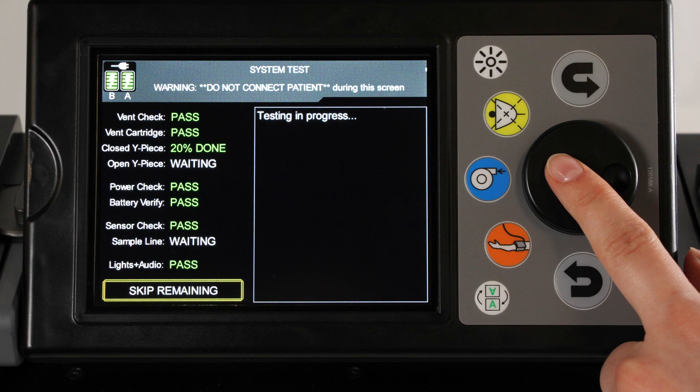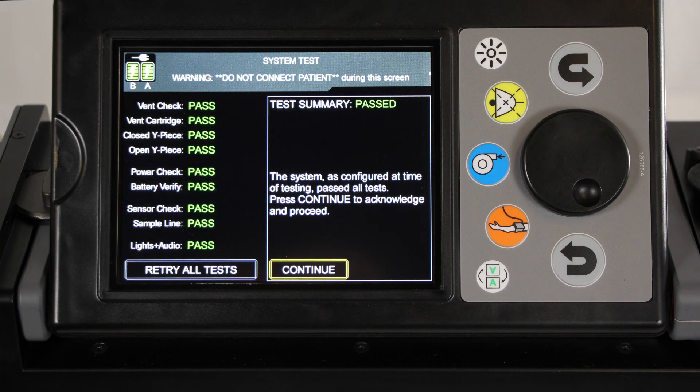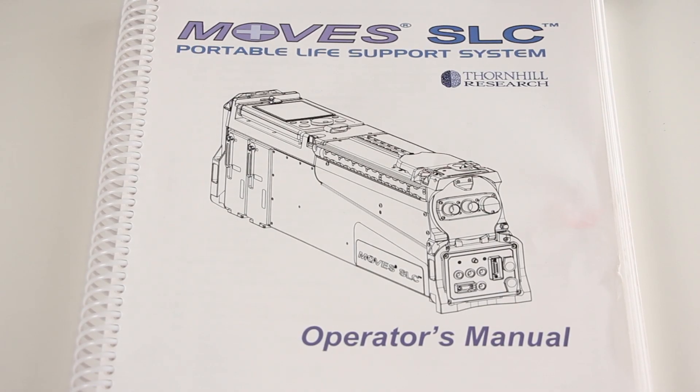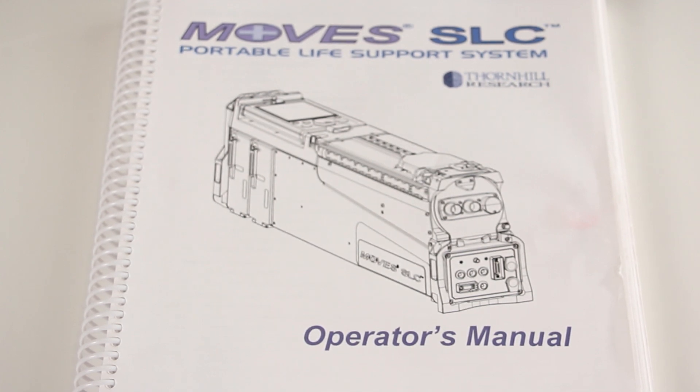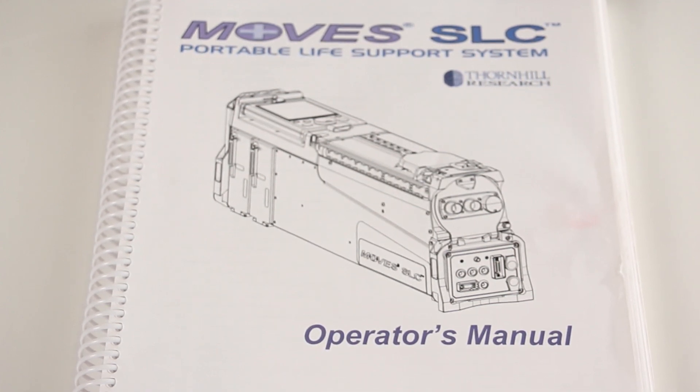Using the jog wheel, highlight and select the test which you would like to run and follow the instructions on screen. If all tests are successful, the system test screen displays a test summary indicating all tests have passed. Select Continue to move on to the setup screen. If any individual test fails, please refer to the MOVES SLC Operator's Manual System Test Failure Messages and Causes.